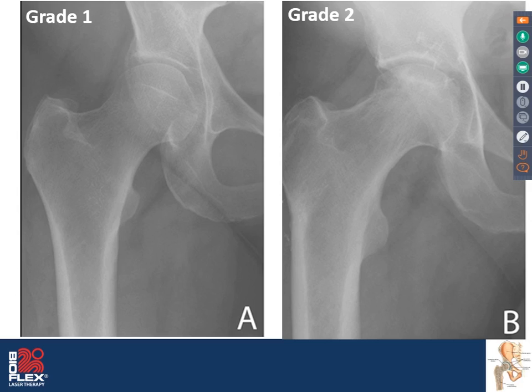So radiographically, just so you can review, you can see the joint line in a grade 1, which really doesn't look too bad, but you can see some whitening or sclerosing around the joint space, which is an indication of some earlier onset of osteoarthritis. Into grade 2, you see more sclerosing or whiteness around the radiograph and a bit more narrowing of the joint line.